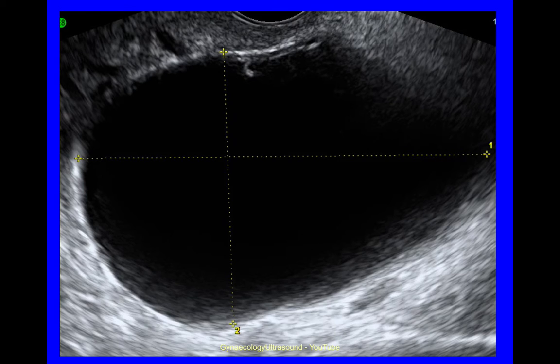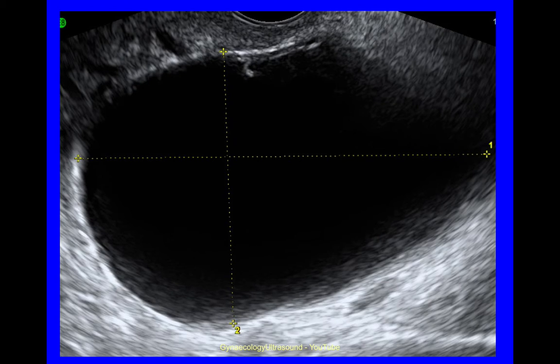This cyst is unilocular — it consists of one locule, no solid material, anechoic cyst contents, and no shadowing.